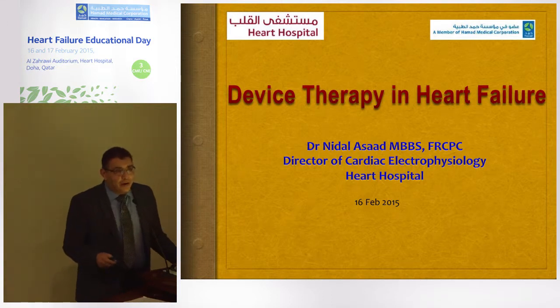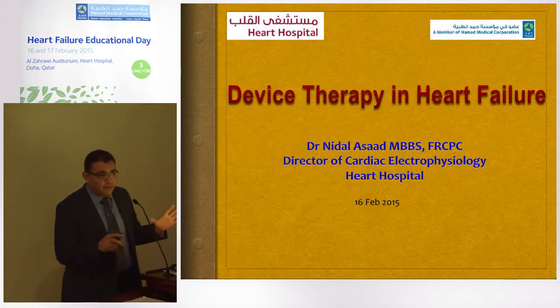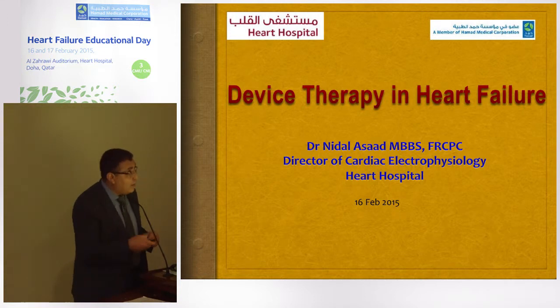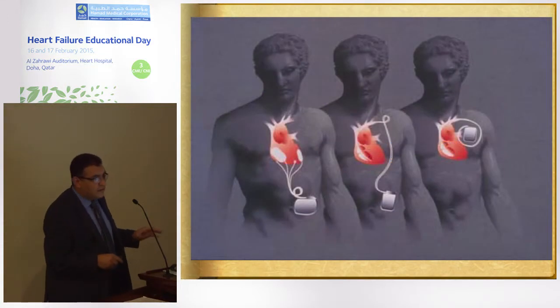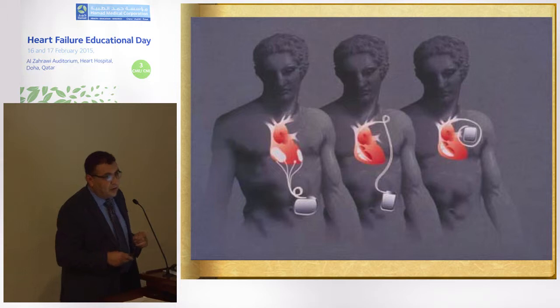Basically, my talk today will be about device therapy in heart failure patients from the electrophysiology perspective. I will start with this slide, which summarizes the history of the implantable defibrillator.